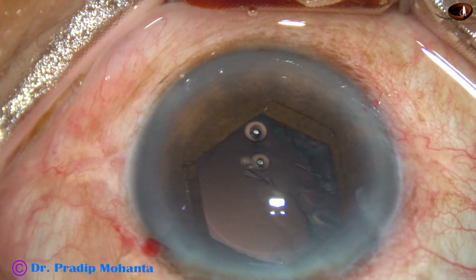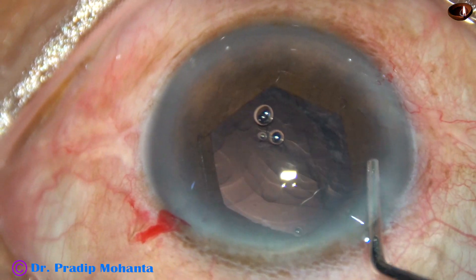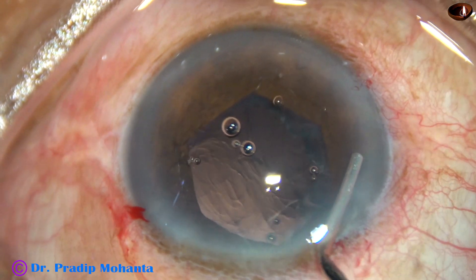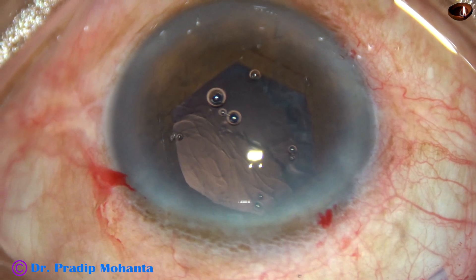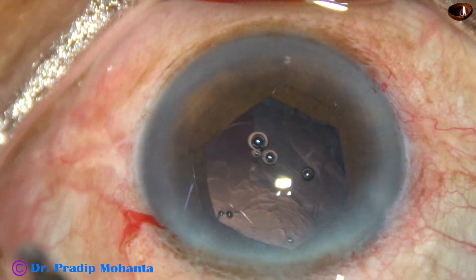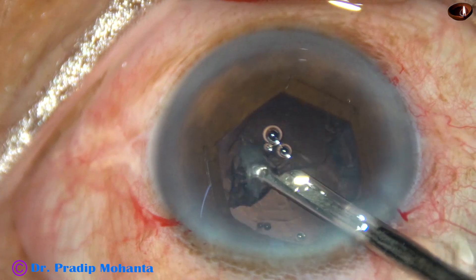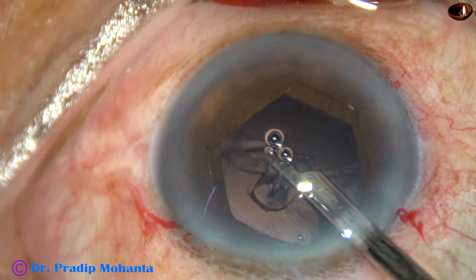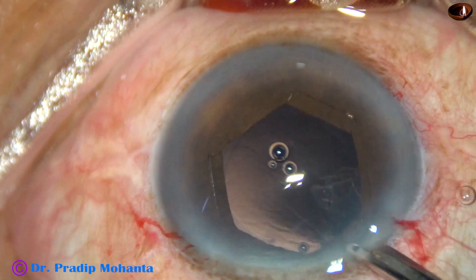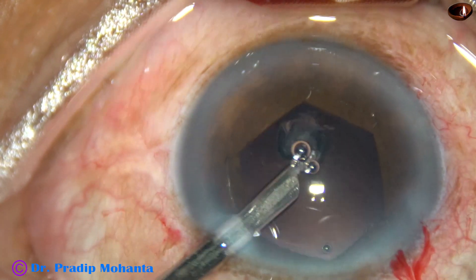Now I inject 2% HPMC, and in this case I am going to use a 23G Simcoe cannula for cortical cleanup. Bimanual irrigation-aspiration can also be used for cortical cleanup, but this instrument works very well in my hands. The cortical cleanup is almost complete.